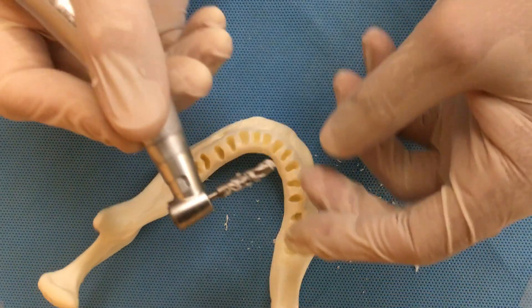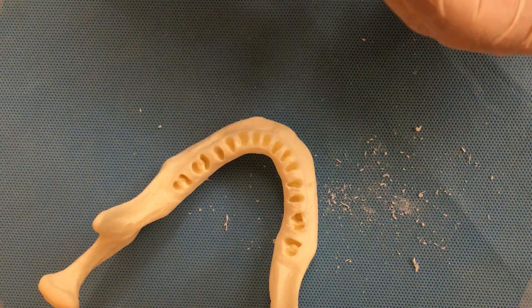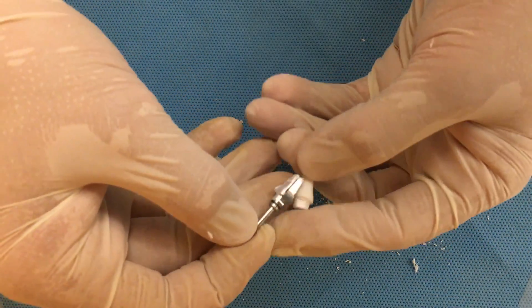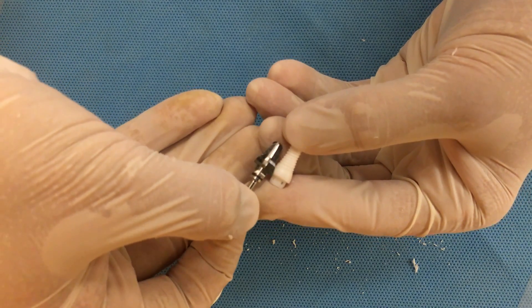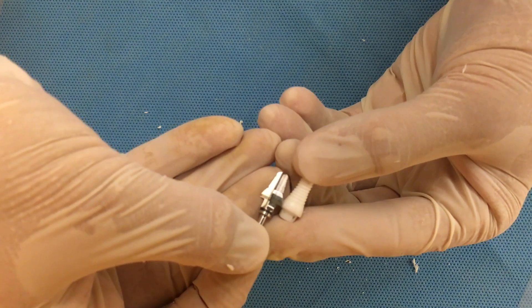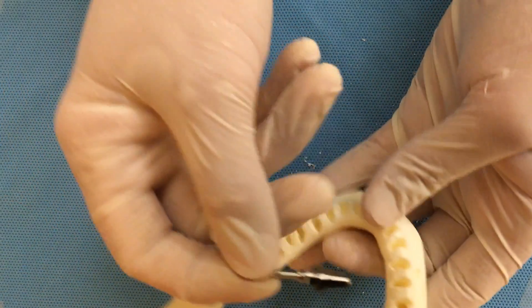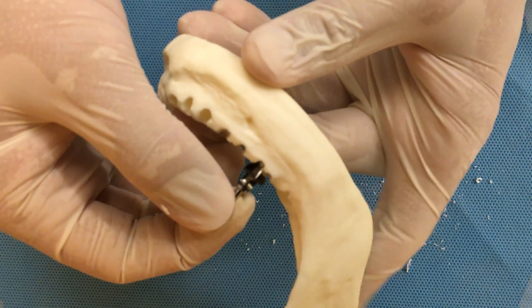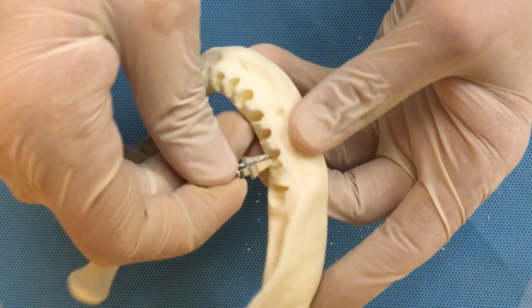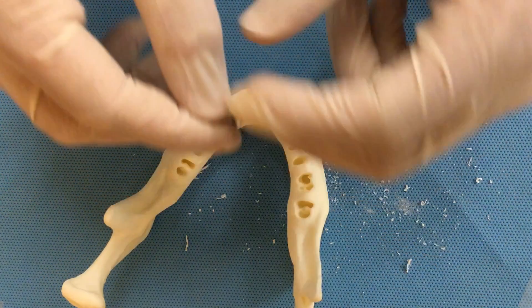We collect this bone and set it aside. Now comes the important part — the countersink. The countersink has exactly the same shape as the implant on the transgingival portion area. On the threaded area, the countersink is a little bit smaller than the implant, but at the gum level thickness we have the same diameter. If we try to place the countersink into the hole, we can see it's not going to go down too deep, so we must use the countersink to make some adjustment on the interproximal bone and also the inter-radicular bone.